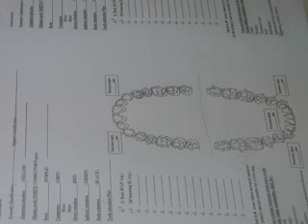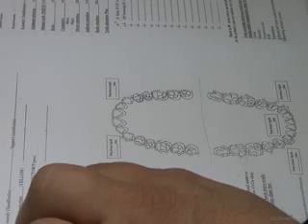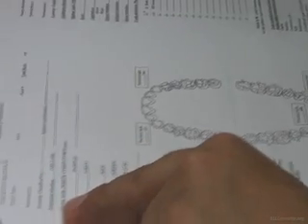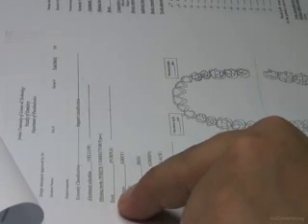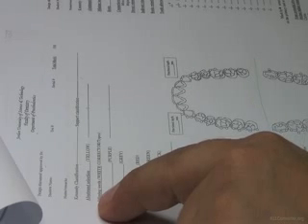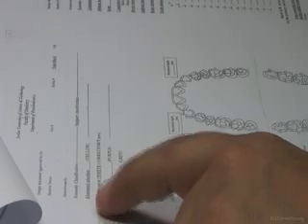They take rests on them, and definitely the other components of retention. So even if the tooth is close, it doesn't mean it's a primary abutment, so we have to check the quality of the tooth before deciding. Missing teeth, we're going to wipe them away by corrector. Teeth intended for extractions, we leave them. We don't draw on them, but we leave them on the page to note for the technician that there is a tooth here, even if it's planned for extraction.